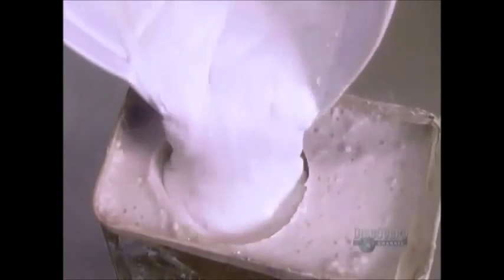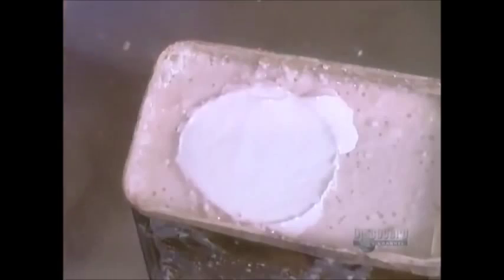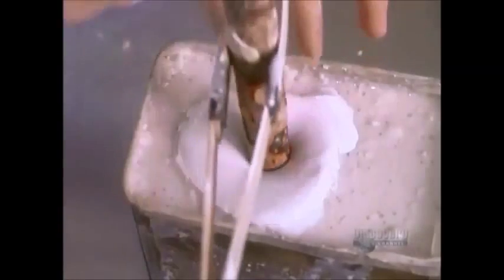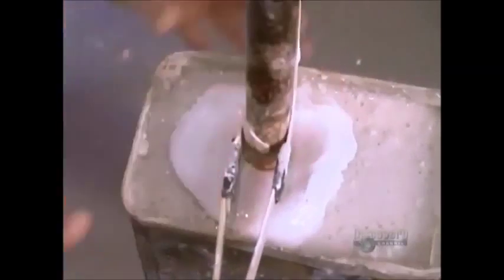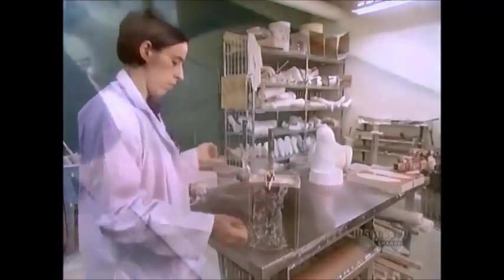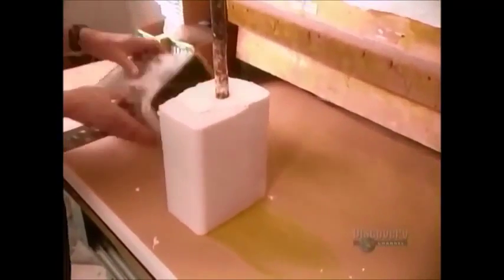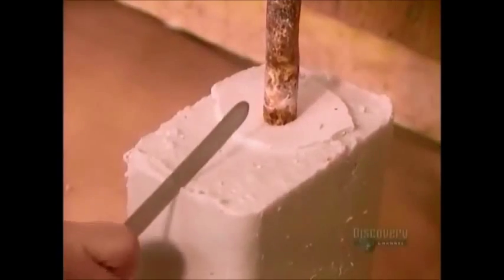A couple of hours later, it's stiff enough to be used as a negative mold. They pour in plaster of Paris, then insert a metal rod. The rod is what will later allow them to mount the dried plaster to work on it further. The plaster takes about an hour and a half to harden. They cut off the algin.